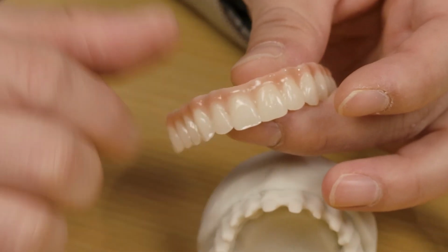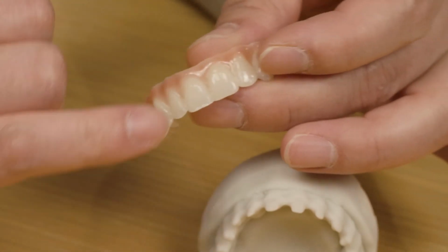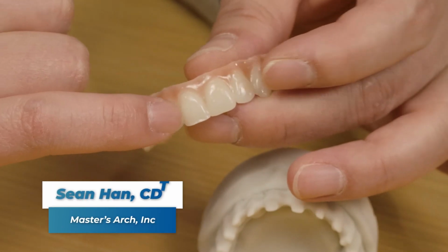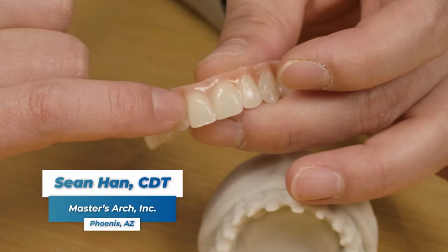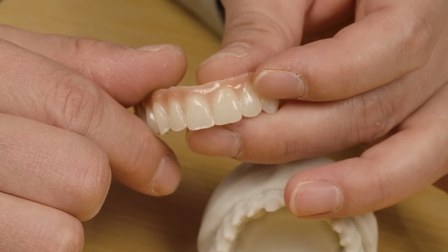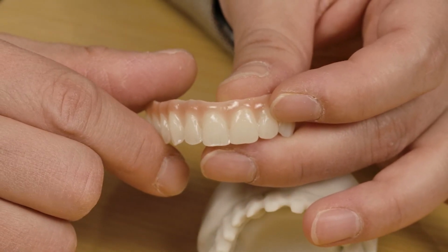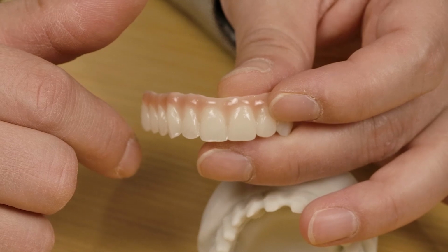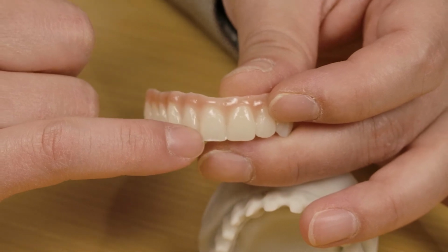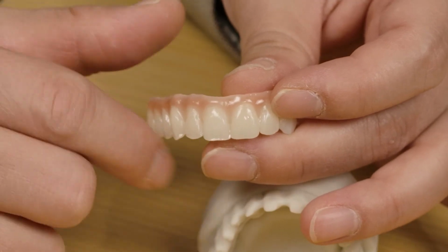What I have done for demonstration purposes, I have cut back number 8 through number 5 only on the facial aspect. Using dental software, I have cut back 0.5 millimeter, and I have manually reduced to describe the internal mamelon shape. And that shape becomes my color map, and we're basically using CZR paste stain to create the contrast game here. So low value on a more translucent area that we want to describe, and higher value where you want to point out.